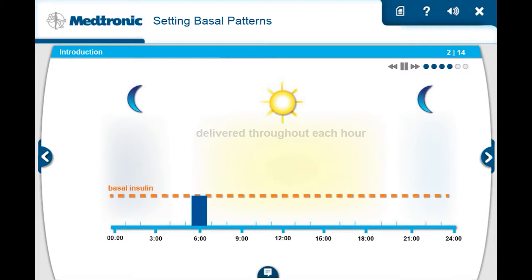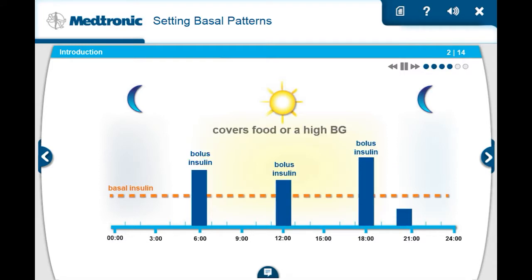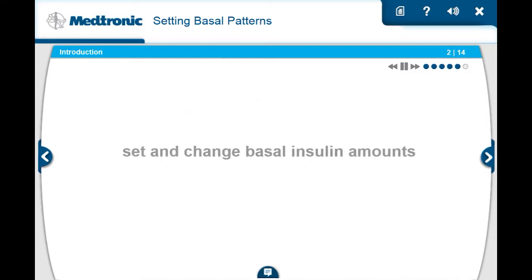And bolus insulin, which is larger amounts of insulin you tell the pump to deliver to cover your food or if you have a high glucose. In this course, we'll show you how to set the basal insulin amounts into your pump and how to change them when you need to.